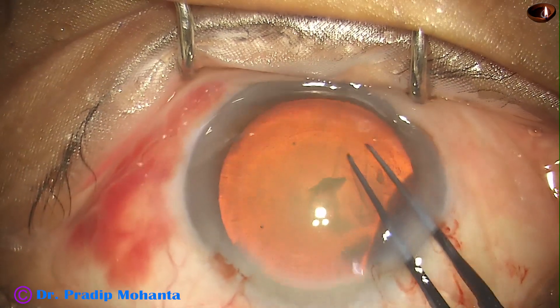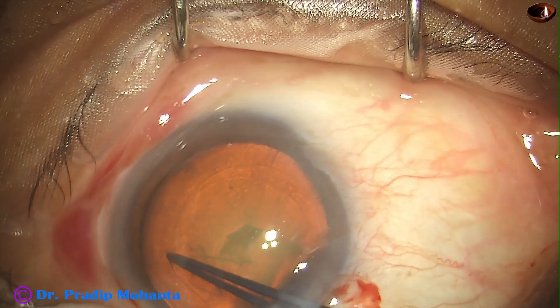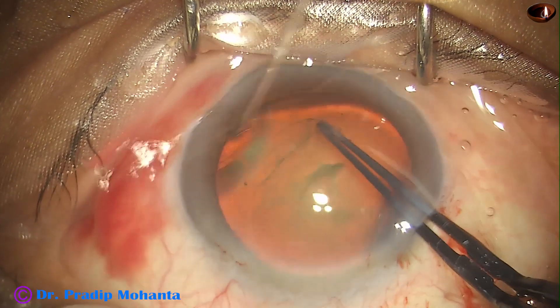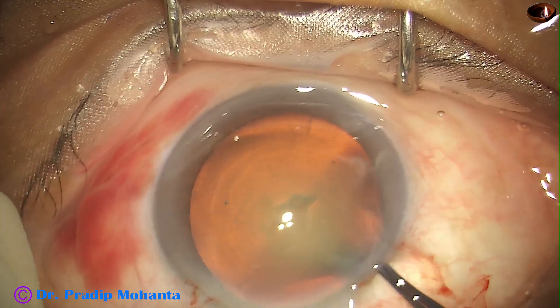I am doing this rhexis along the border of the nucleus — that is, along the margin which divides the nucleus with the epinucleus. In this case, I need rhexis in a clockwise movement.